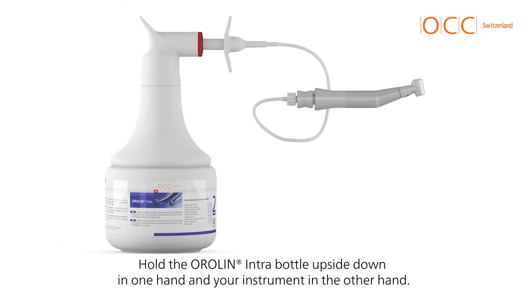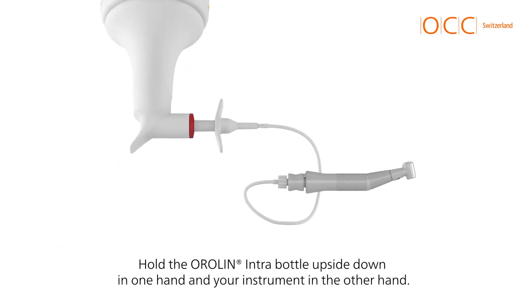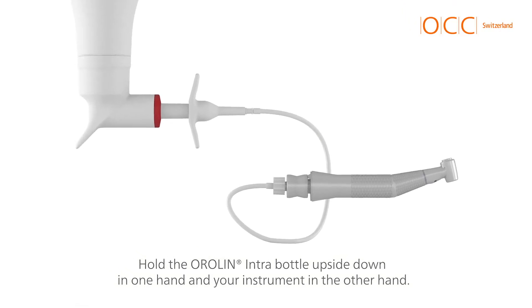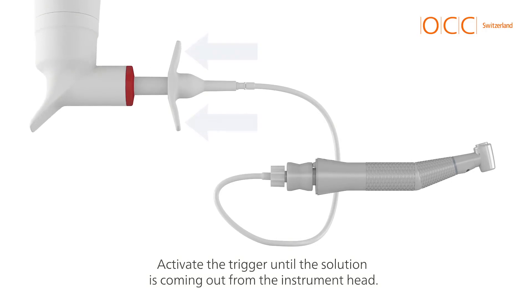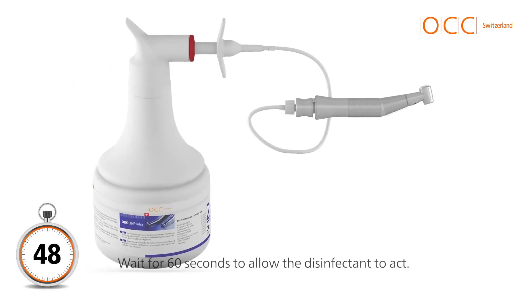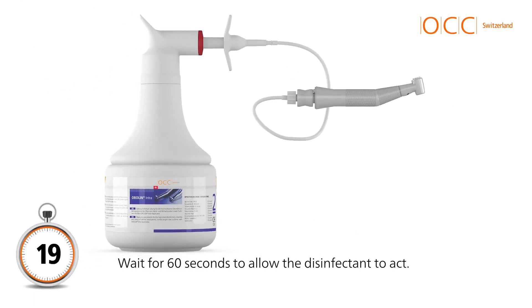Hold the Aurelin intra-bottle upside down in one hand and your instrument in the other hand. Activate the trigger until the solution is coming out from the instrument head. Wait for 60 seconds to allow the disinfectant to act.